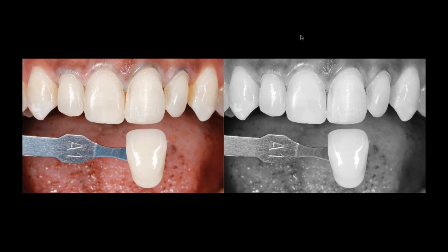Because if we are expecting to change, for example, from an A4 to a B1 with a very thin veneer of 0.5 or less, we won't be able to do that with a feldspathic ceramic because it's too translucent. So this opens the door to the materials that we're going to talk about later today, when we need to modify the color of the final restoration more abruptly compared to the patient's initial situation.